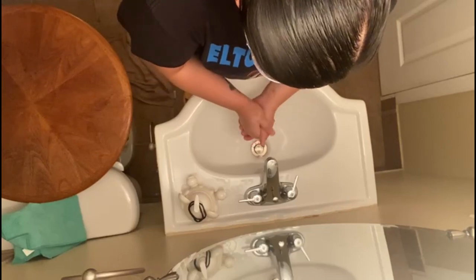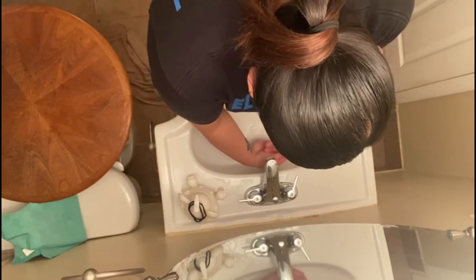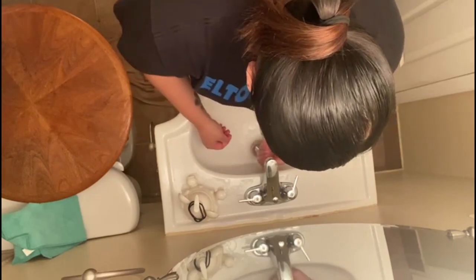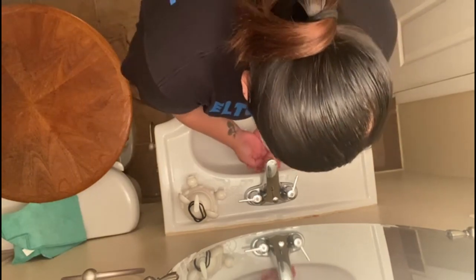First, perform hand hygiene. Use an alcohol-based hand sanitizer or wash your hands with soap and water to remove or kill germs on your hands before touching clean PPE, preventing contamination.